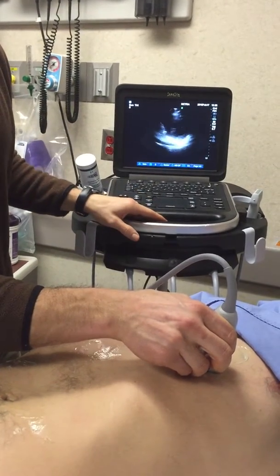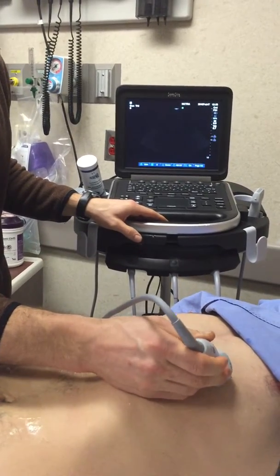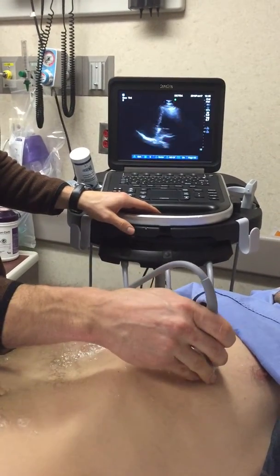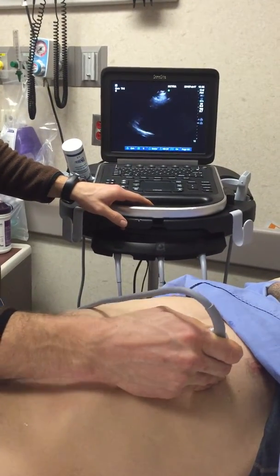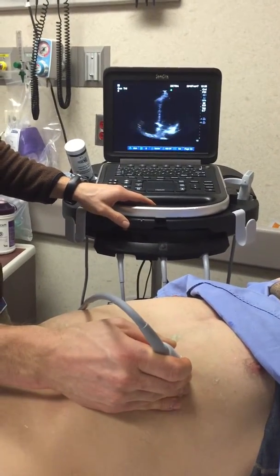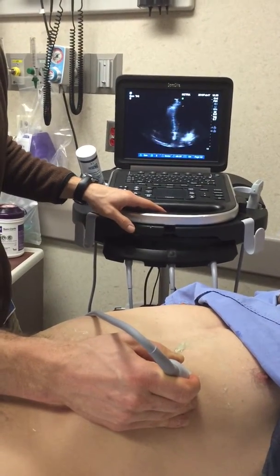Then the third view you'd like to try is the apical view. So you slide down, it's usually a little medial and inferior to the left nipple, and you try to sit right on top of the rib. And so we'll try to get a 4-chamber view. So there's a decent 4-chamber view.